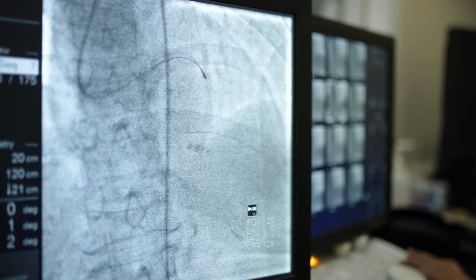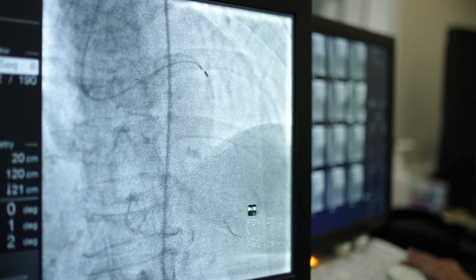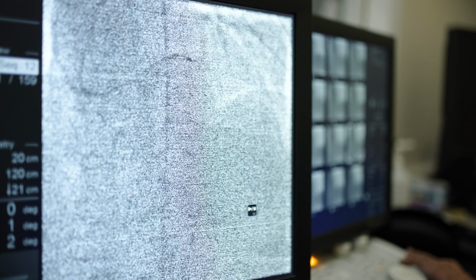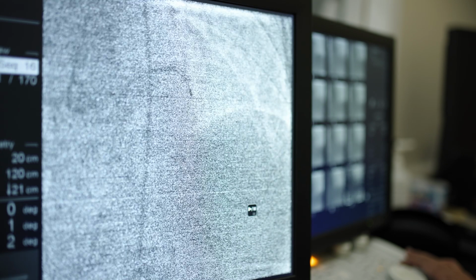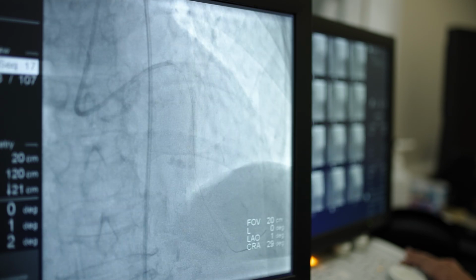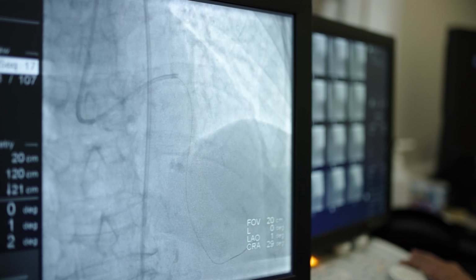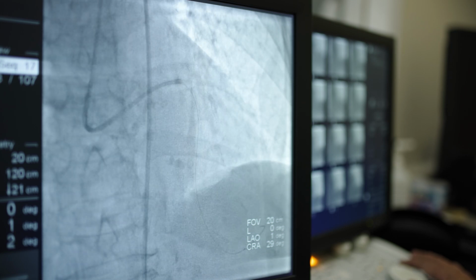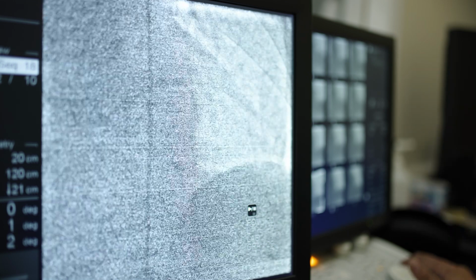And then we were asking ourselves why it doesn't want to go through the full length of the lesion. So after many ablation episodes, we decided to take it out, and then we passed a new wire, and this is the balloon that goes very smooth now, because we ablated what's called a calcific nodule, which is like a very small rock at the beginning of the lesion that prevented all our equipment from going through.